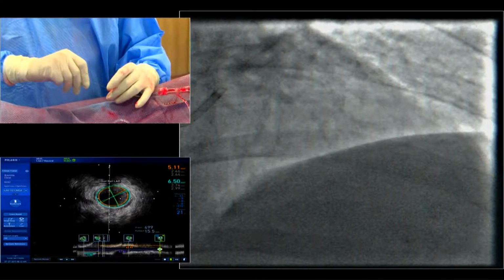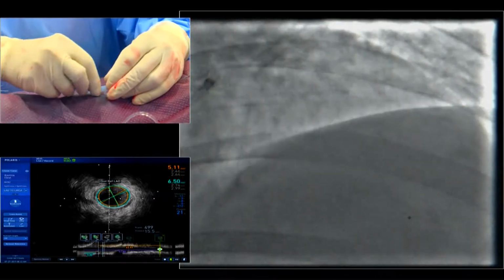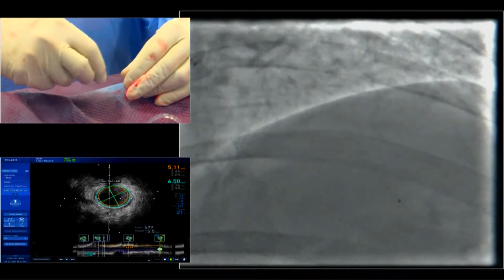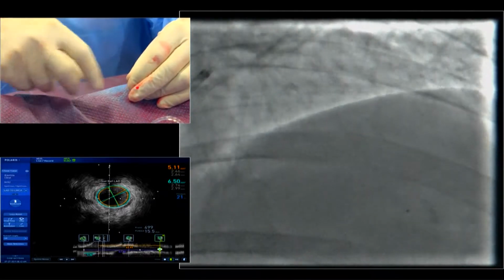In that case, can we deploy that stent? There is also a point, post dilate it so that we can avoid that. What is the problem in that? Actually, if you take a 4 millimeter stent and okay, Shuvanan, please.